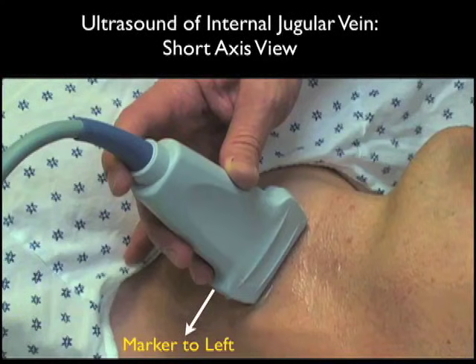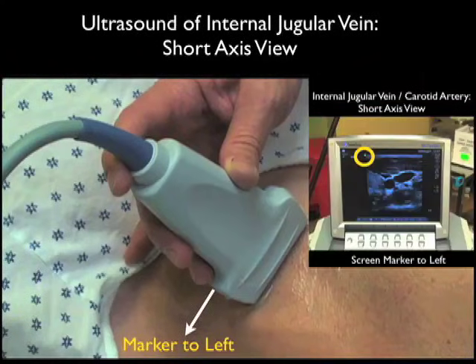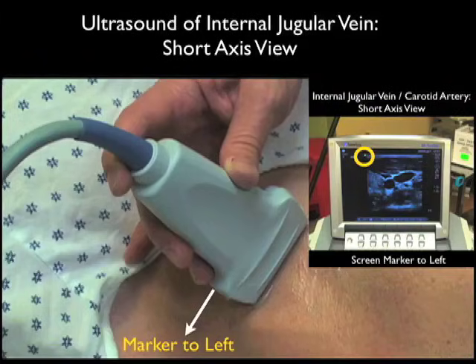The reason for that is the orientation of the probe marker will line up to the orientation of the screen indicator dot, which we see here is oriented towards the left on the ultrasound screen. Thus, the left side of the probe will orient directly to the left side of the screen, and this will allow us to orient ourselves as we place the needle underneath the patient's neck and cannulate the vein.